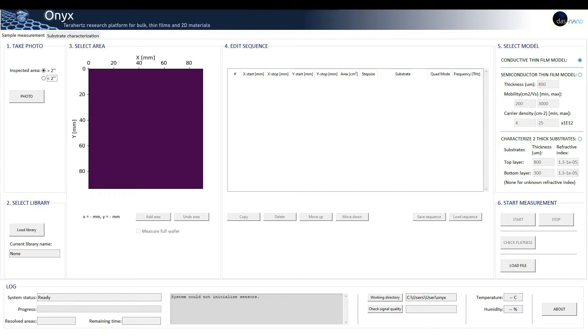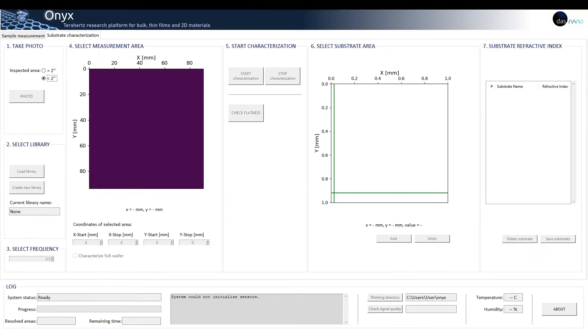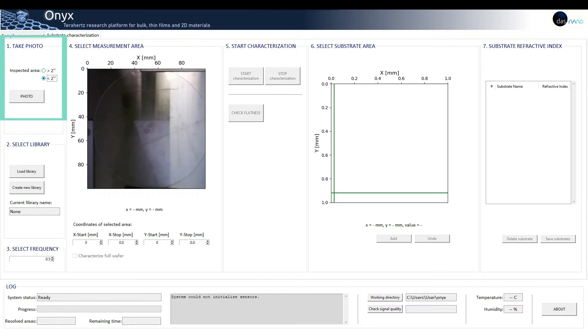We will see this later during the demo. First of all, we will characterize our substrate using the substrate characterization tab. This tab is divided into seven different sections. One: take photo.